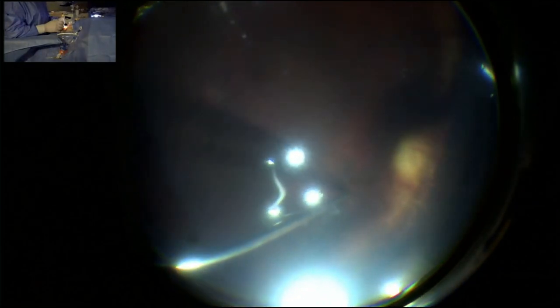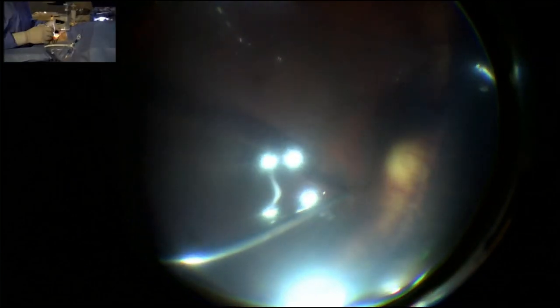And wait a few seconds to clean the fluid as much as possible. So retina is now completely attached. So I will do laser after this, but I will fill the vitreous cavity full with perfluorocarbon after drying the supraretinal fluid. It's almost finished. This area, there is no fluid. As you see again, the indentation is coming here, and it's coming. And now we can check, aspirate the fluid. Yeah, there is no fluid in the supraretinal space. Retina is completely attached.